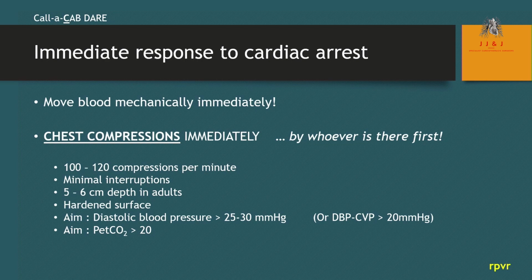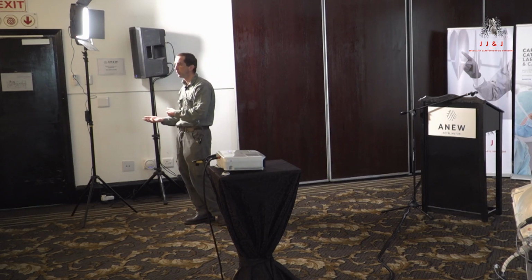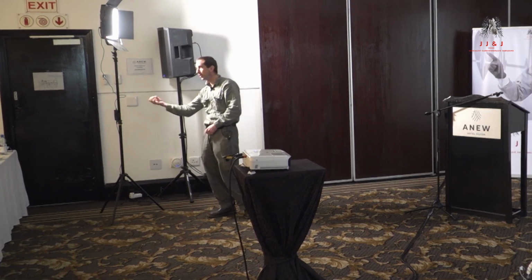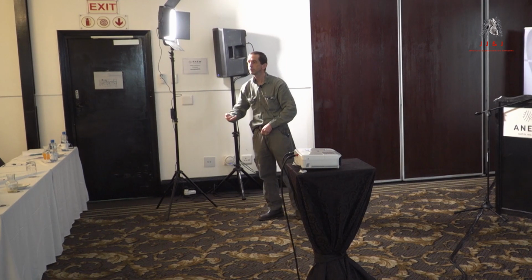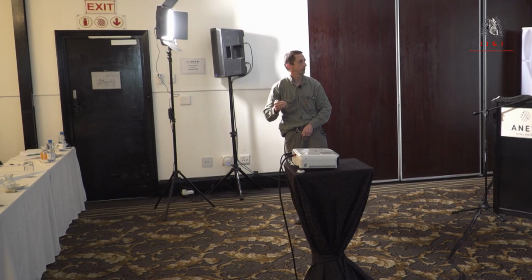You need to be pushing onto a hardened surface, and that is a real problem because we've got lovely soggy beds and air mattresses. You need to have the rapid ability to put a board under the patient, and if your patient happens to be on an inflatable mattress, know how to deflate that mattress. And some do deflate rapidly and some don't, and that could be a real problem. If you've got a non-deflating soft mattress, your chest compressions may not work.